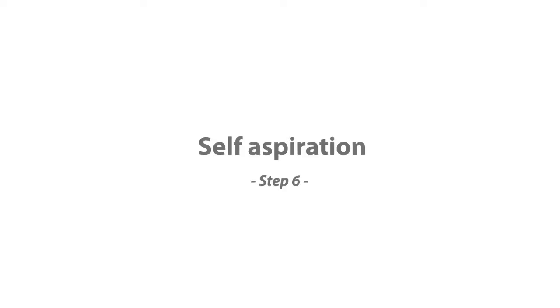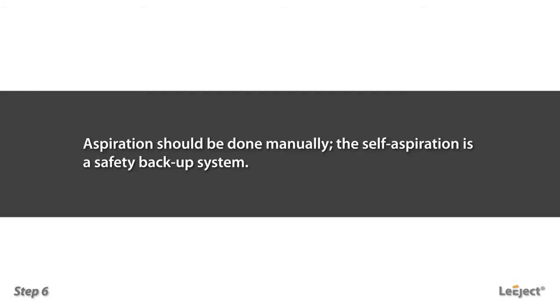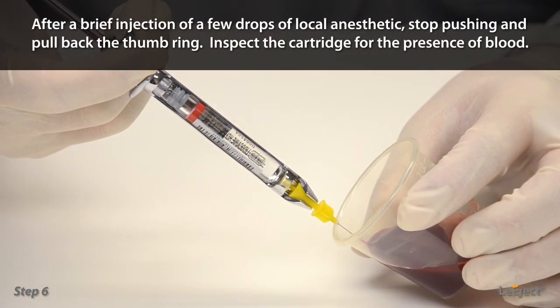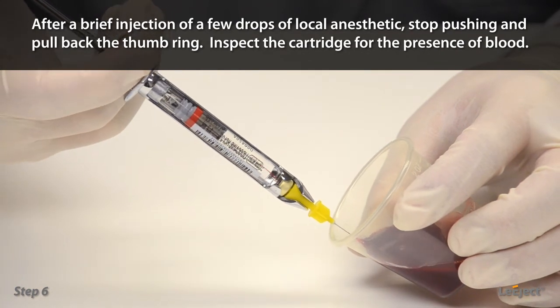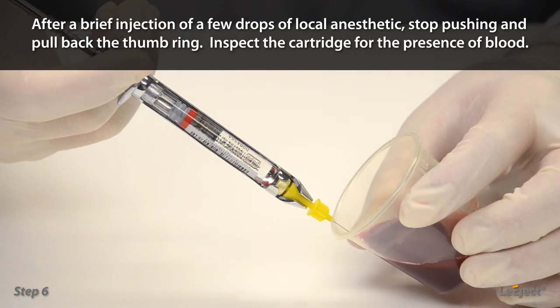Self-aspiration: aspiration should be done manually first; the self-aspiration is a safety backup system. After a brief injection of a few drops of local anesthetic, stop pushing and pull back the thumb ring. Inspect the cartridge for the presence of blood.